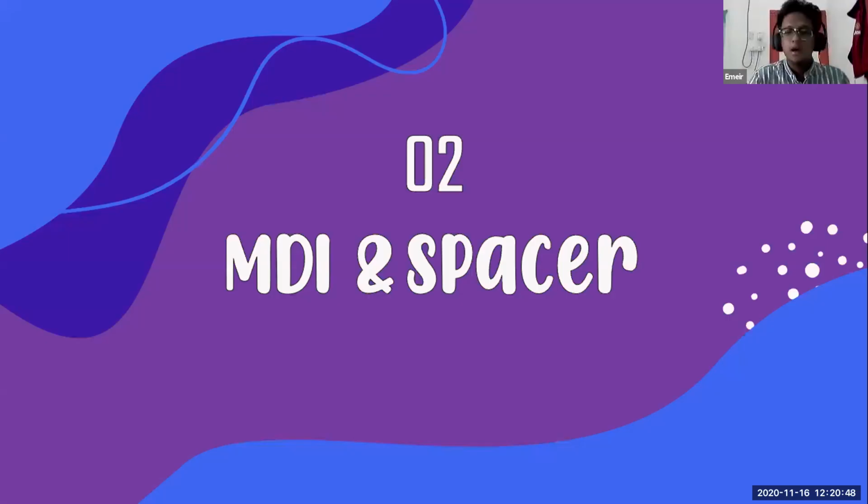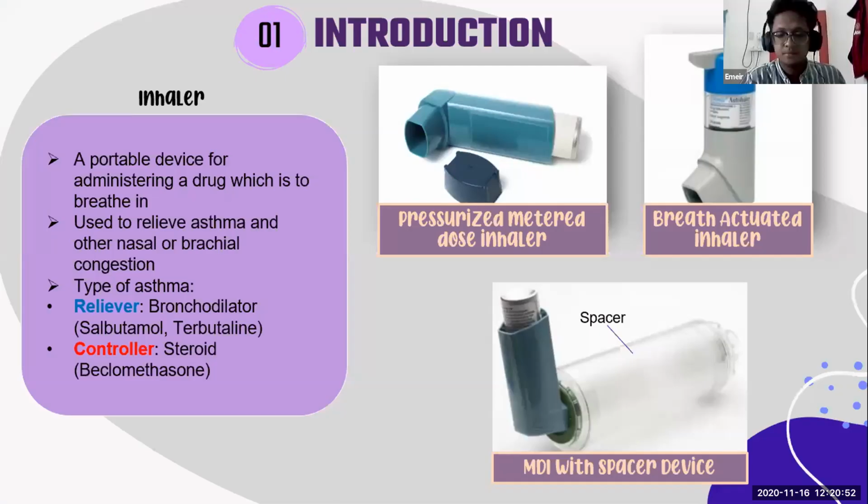Next, continue with MDI and also spacer device. So we must understand what an inhaler is. An inhaler is a portable medical device that administers medication to the lungs in an aerosolized form, which is to breathe in. It is used to relieve asthma and other nasal or bronchial congestion.